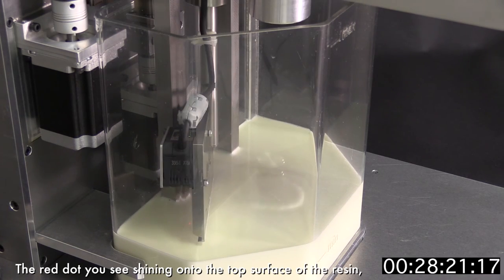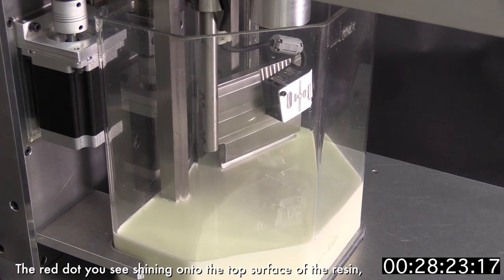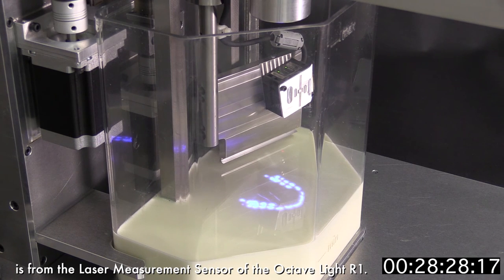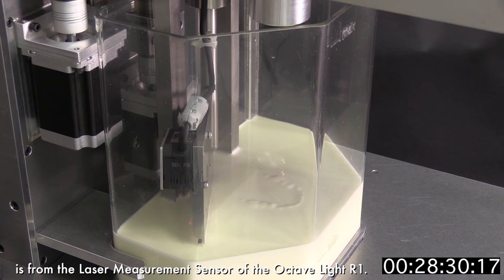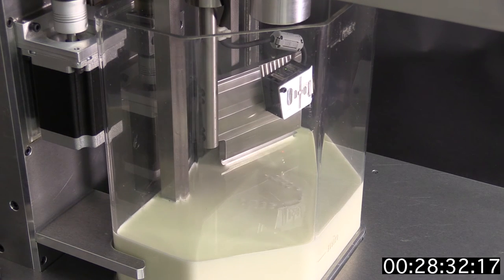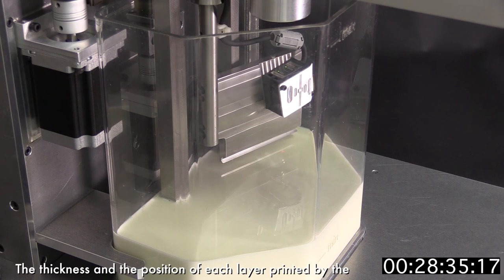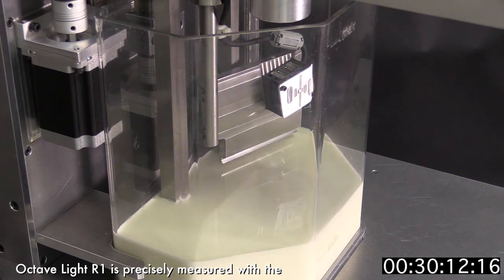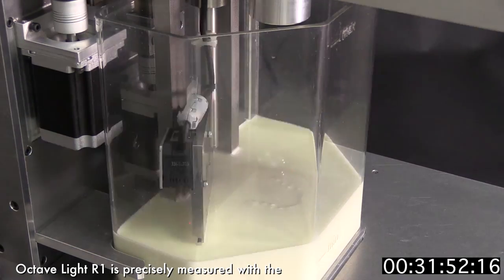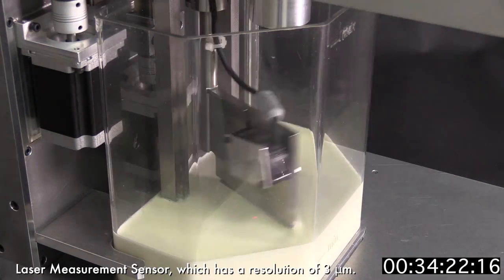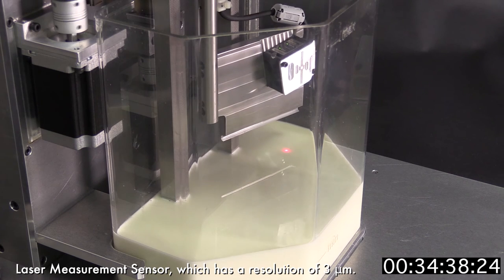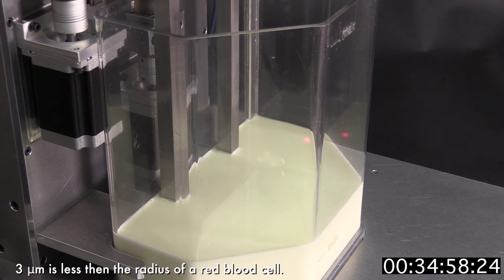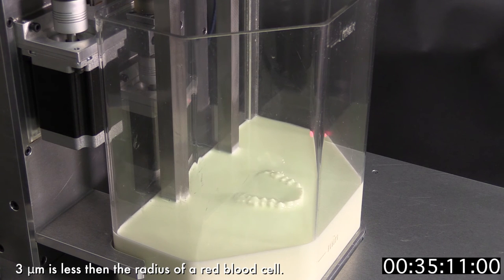The red dots you see shining onto the top surface of the resin are from the laser measurement sensor of the Octav Light R1. The thickness and the position of each layer printed by the Octav Light R1 is precisely measured with the laser measurement sensor, which has a resolution of three micrometers. Three micrometers is less than the radius of a red blood cell.